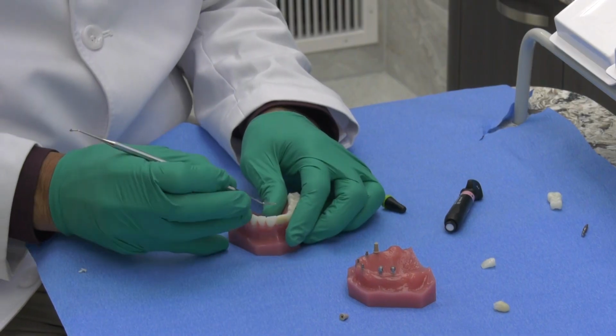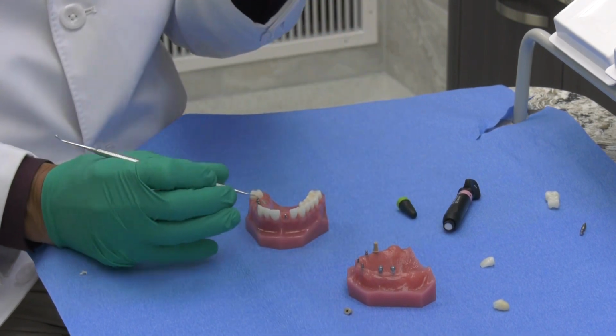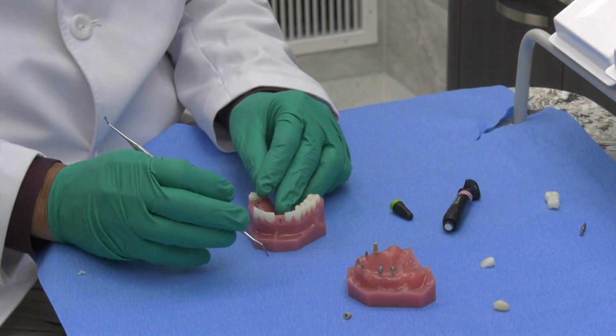When the patient returns, you basically can take a spoon excavator and lift that healing cap right off along with the temporary, and you have your temporary aside and you'll be able to cement your crown right after that.